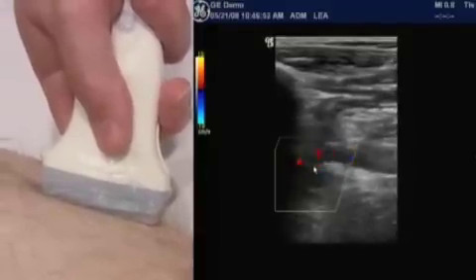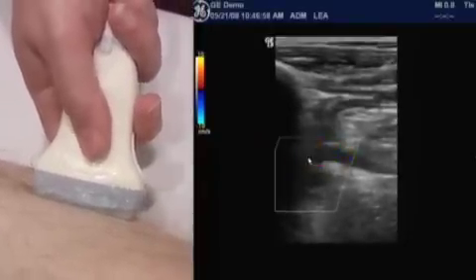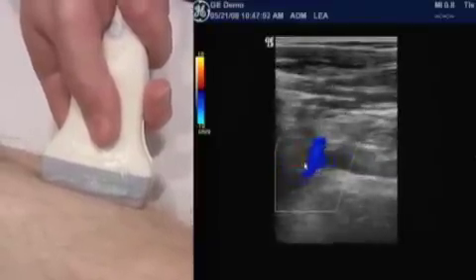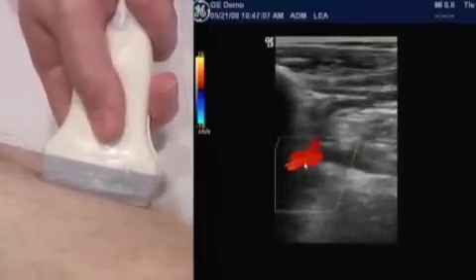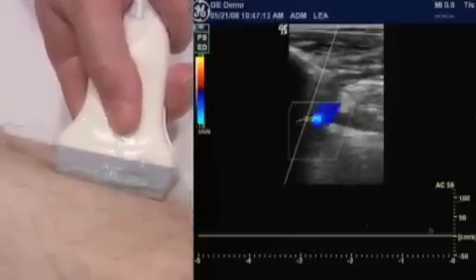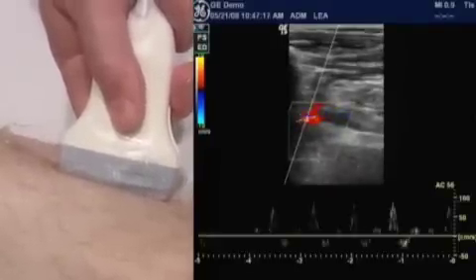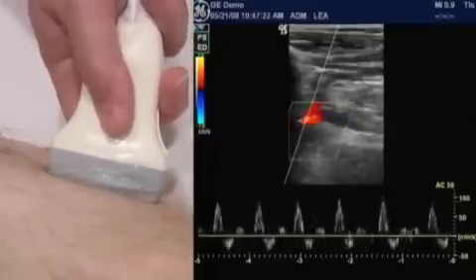As you can see where my hand is, it's coming up. It's going to go behind the tibia through an opening in the interosseous membrane and hook back up to the popliteal. So we've got a nice, and there's the companion veins alongside as I move here and there, but we should still see that nice multiphasic pattern. And that's exactly what we're getting. Okay, so basically we could follow it further than I thought, but again, about at this point, it's going to dip down and go away from us.